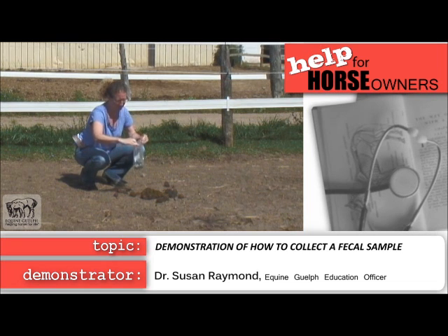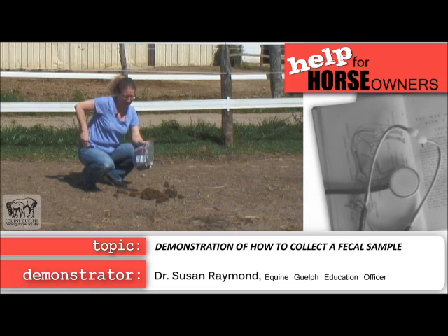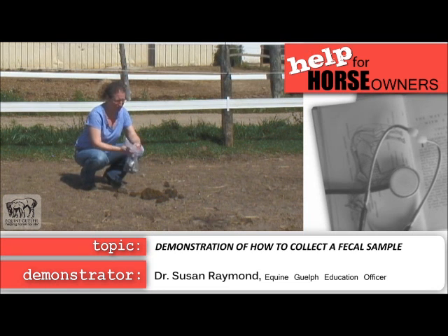Close the bag. Take a second Ziploc bag. Make sure you've identified the horse's name and the date from whom the sample is from.